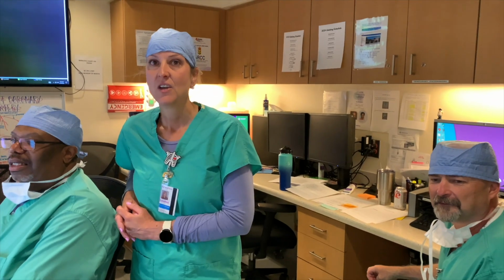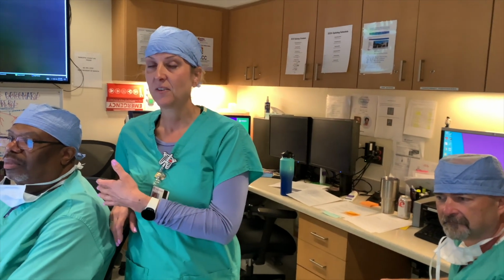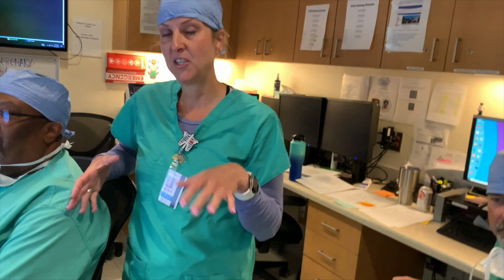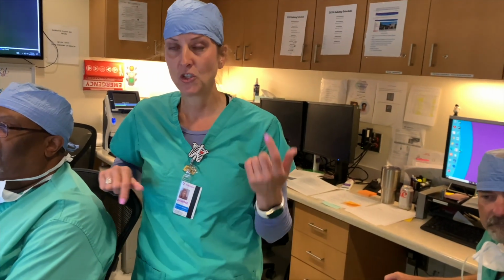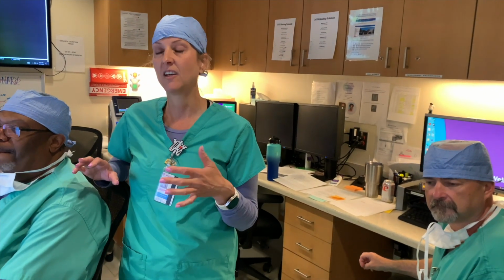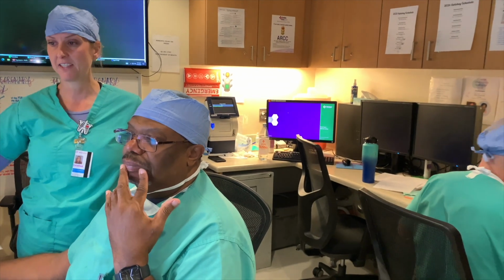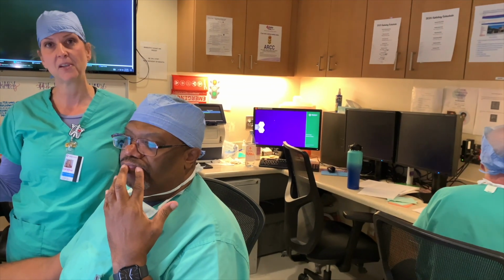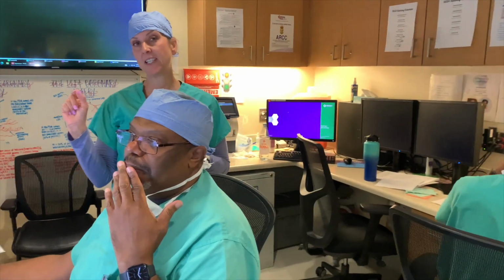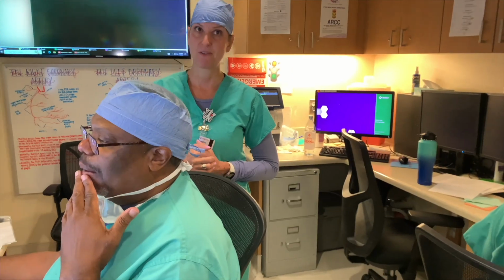Everyone has their role. Amber, Phil, and I all do the same job. We all scrub in next to the doctor. We are basically 100% patient contact, where the nurses are circulating the room, paying more attention to the monitors, what's going on with the patient, and giving medication. All of the patient's vital signs are up here, so he's constantly monitoring that, because when we're in there messing around in your heart, we can give it a little tickle and everything can dip fast.